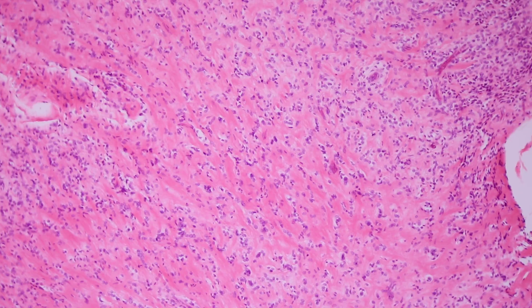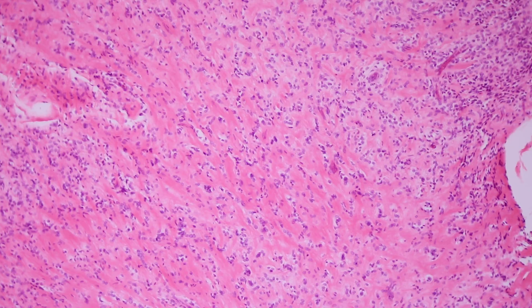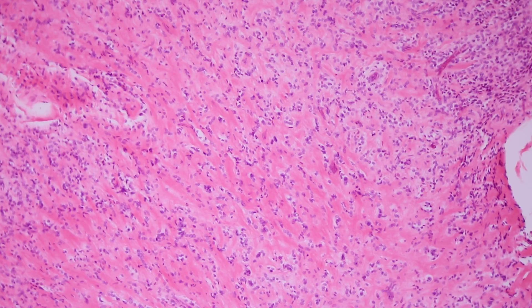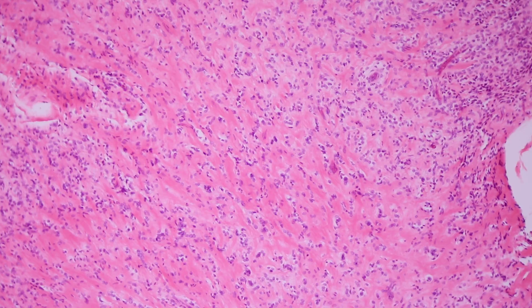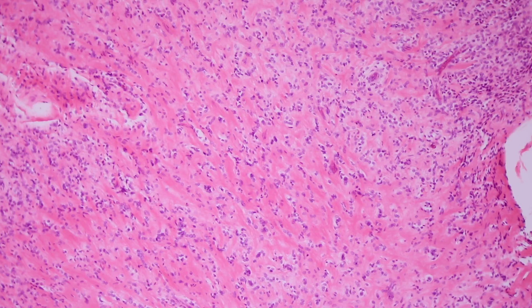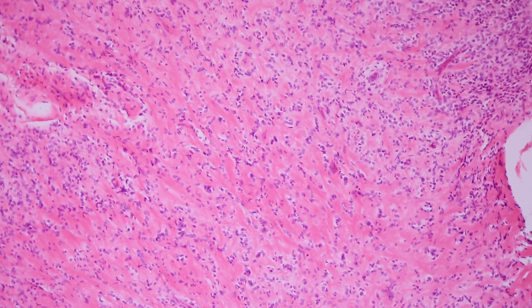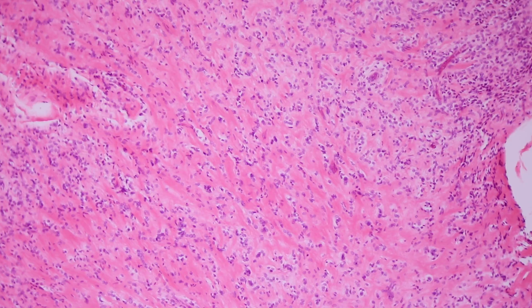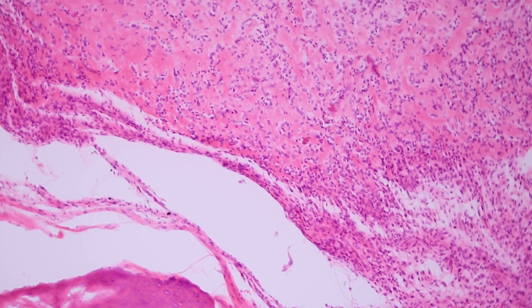Whenever you see cords, rows, or chains of spindle or round cells in soft tissue pathology, there's a handful of things to consider. Ossifying fibromyxoid tumor is one of them. Myoepithelial tumors often make cords and chains. Epithelioid hemangioendothelioma, an unusual vascular tumor, shows the same pattern. And chordomas, which usually occur in or around the spine, can rarely occur in soft tissue as well.